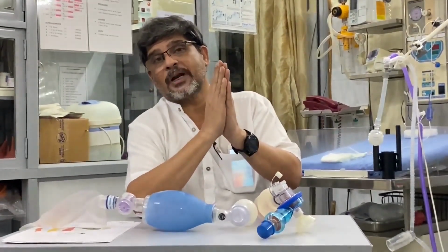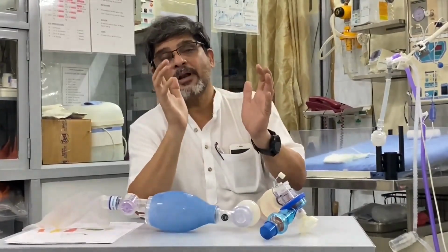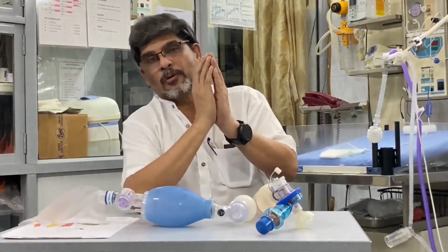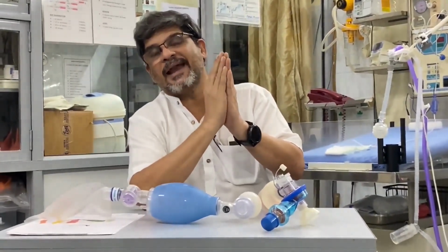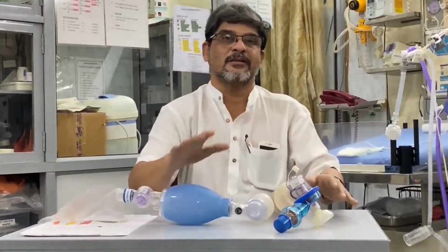So we do lung protective ventilation, which is known as open and keep it open. Open it with peak inspiratory pressure and keep it open with PEEP. That is the basic physiology of ventilation.